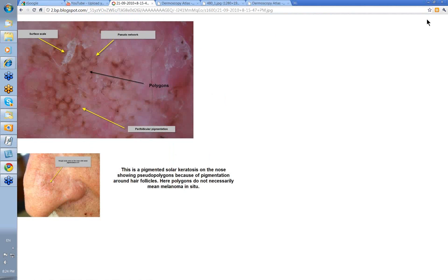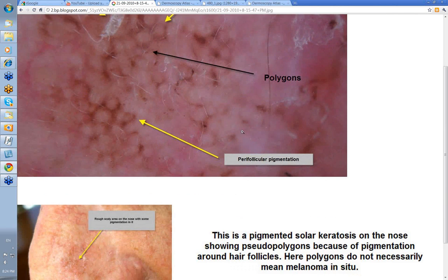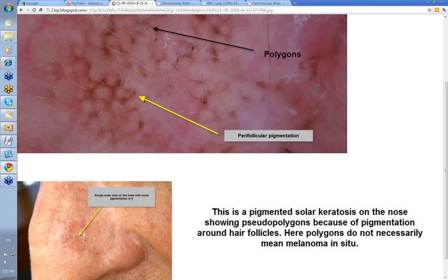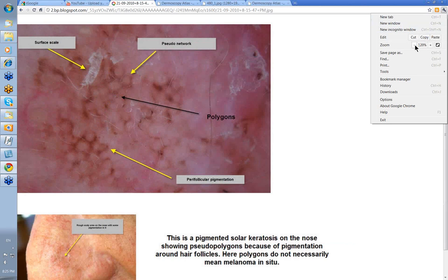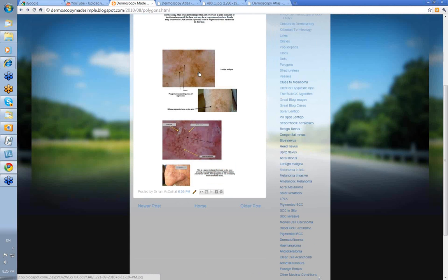Let's look at these perhaps pseudo-polygons that you may see on the face. This is a lesion on the nose - a rough scaly area on this gentleman's nose that had some pigment within it. Histologically it was a pigmented solar keratosis, showing pseudo-polygons because of pigmentation around hair follicles. Here polygons do not necessarily mean melanoma in situ. You can see these sort of pseudo-polygons that you may see on the face in a pigmented solar keratosis. So polygons would appear to be an important structure for extra-facial lesions and seem to be a marker for lentiginous melanoma off the face.